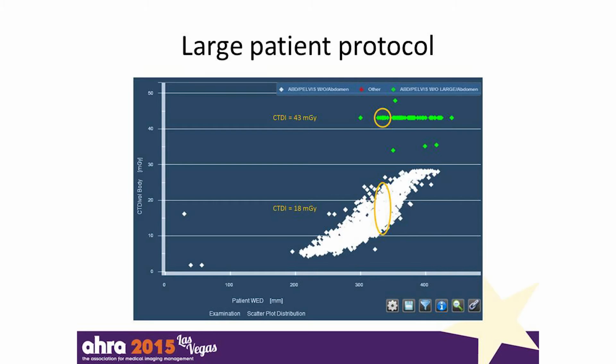And this is why I say it's not enough just to look at the protocols. You need to look through the data with a fine-tooth comb. You need to find out where are the places where we can make a difference. These 2 protocols should give a much more similar dose.